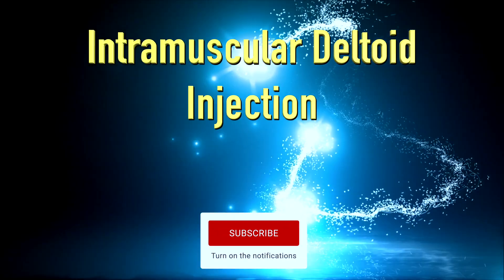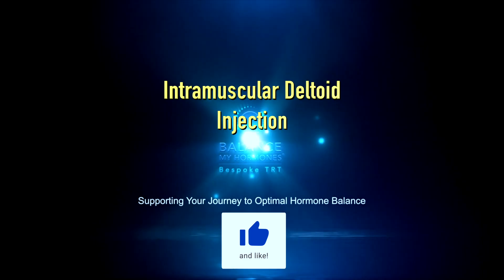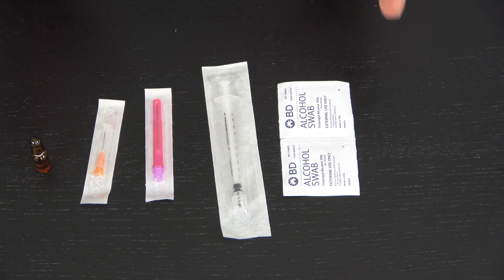Hello and welcome to another Balance More Hormones video. Today we're going to show you how to prepare and do an intramuscular deltoid injection. As with any other injection, we've got our stuff ready in front of us.